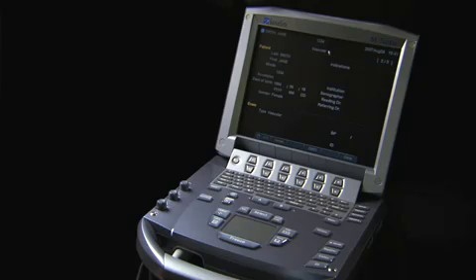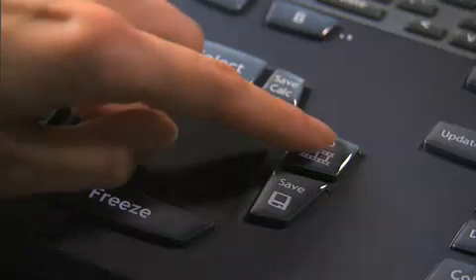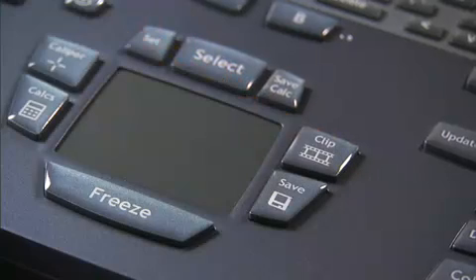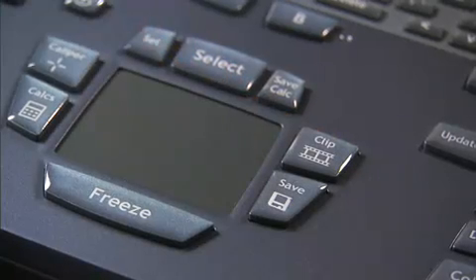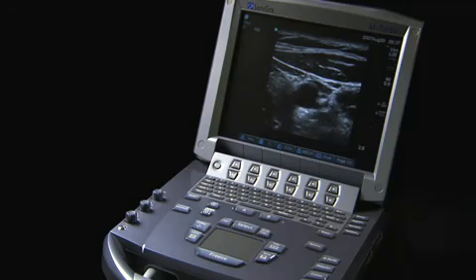To save a clip, press the Save Clip key. A clip length of 2 to 60 seconds can be selected.